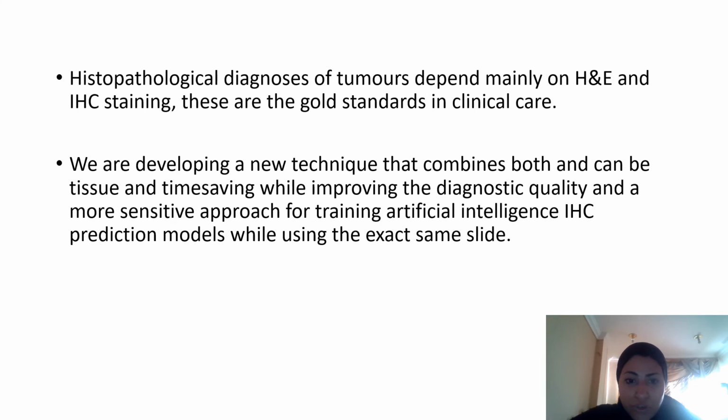So, in conclusion, histopathological diagnosis of tumors depends mainly on H&E and IHC, and these are the gold standard in clinical care. We are here developing a new technique that combines both H&E and IHC and can be tissue and time saving while improving the diagnostic quality, and is a more sensitive approach to train an artificial intelligence model for prediction of IHC on the same exact slide.